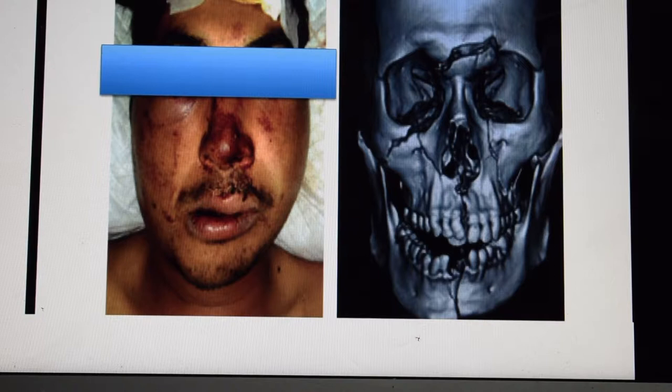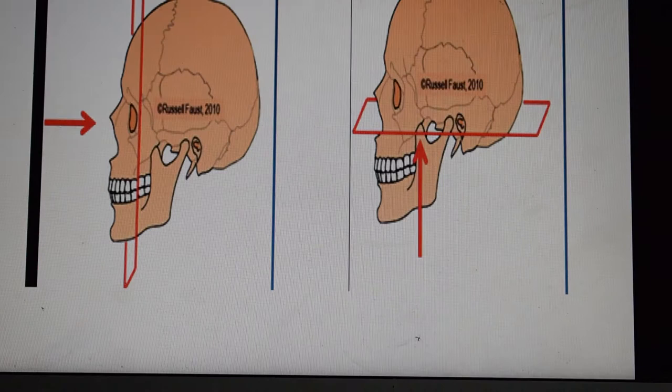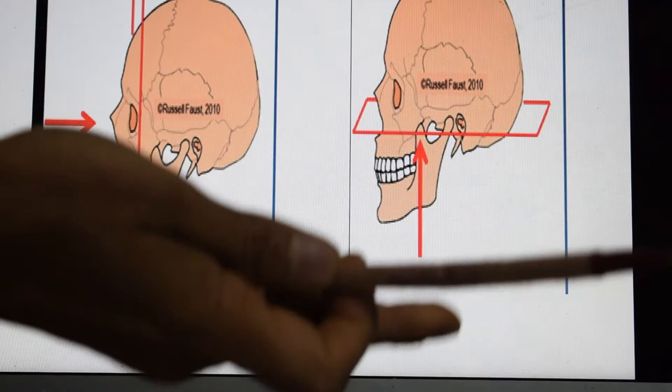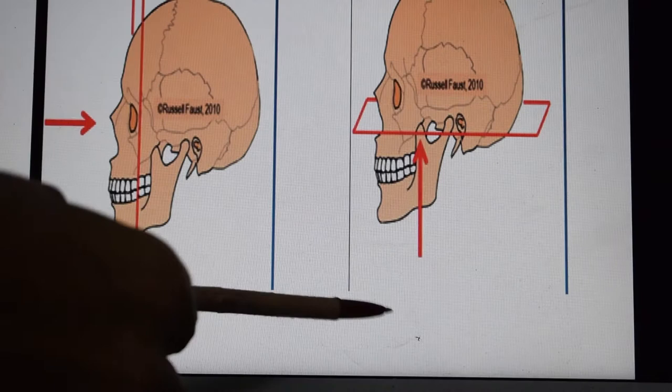There are two cuts of CT scan: one is the coronal cut, taken like this front to back, and the other is the axial cut, taken up and down. So coronal and axial cuts are the two main views we use.